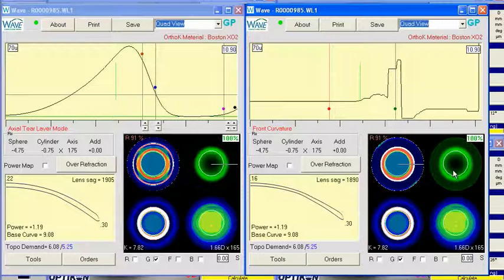So reducing the sag of the lens, decreasing center thickness and mass, hopefully we'll get this lens to center upward, give you a more circular treatment zone, and see if that takes care of the toricity in there. Curiously, this patient is developing a little bit of hyperopia through what I would expect to be kind of a low power lens based on his initial refraction, but I would not reduce the demand any more than it is right now, or any less than it is right now. I'll just try to reposition the lens and see if that takes care of the toricity.